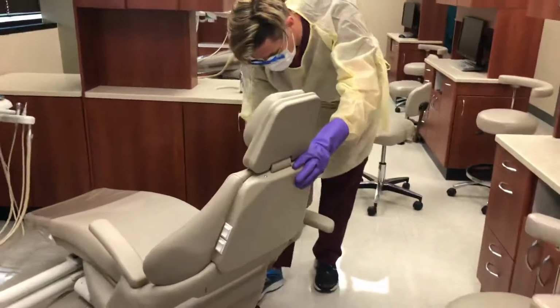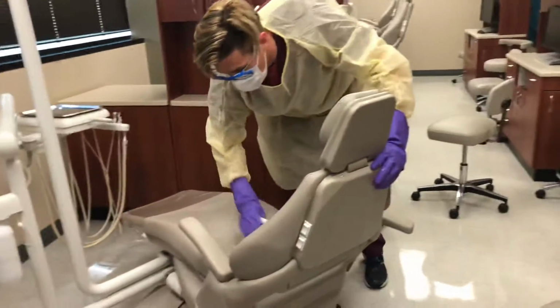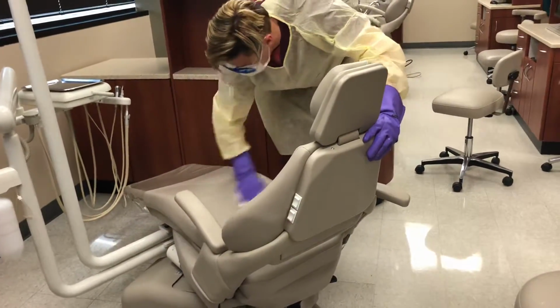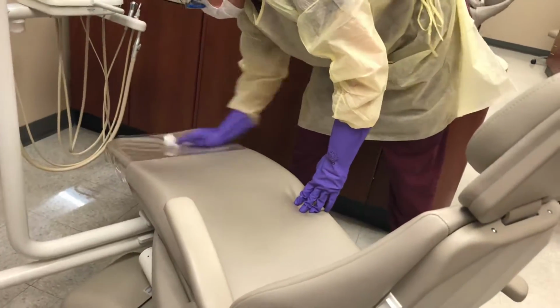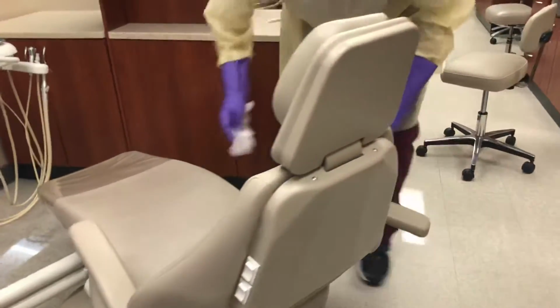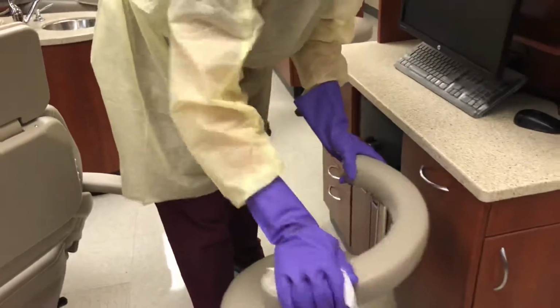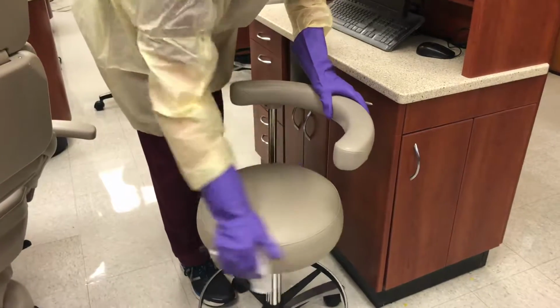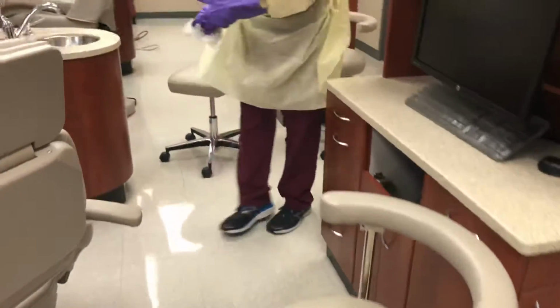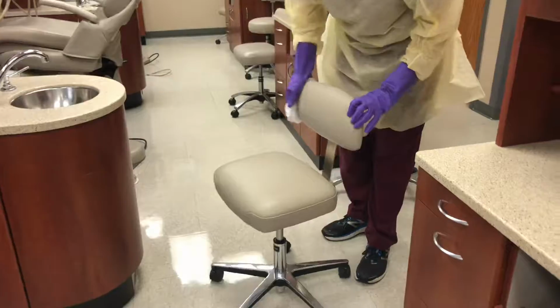Note, if the vinyl needs to be spot cleaned for a hard to clean stain, then a pre-mixed solution of ivory soap and water in a spray bottle may be used. After cleaning with the solution, the soap film must be wiped off with water. If ivory soap and water does not remove the stain, alert the academic support specialist.